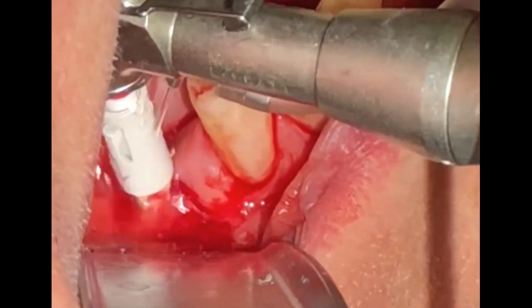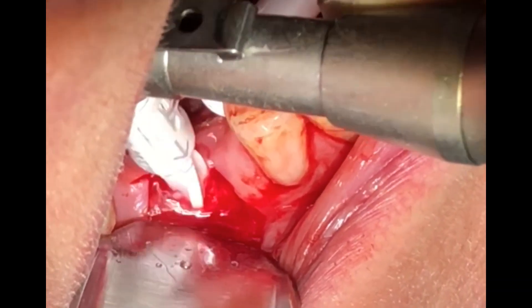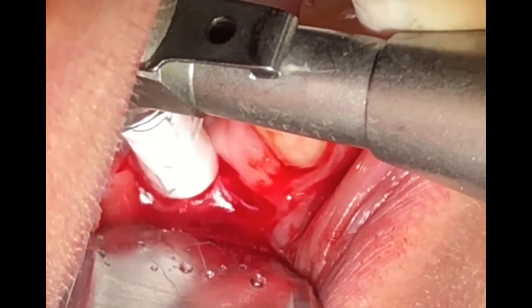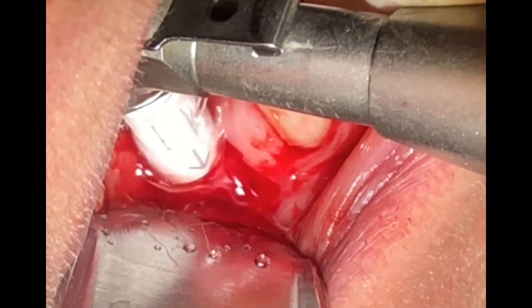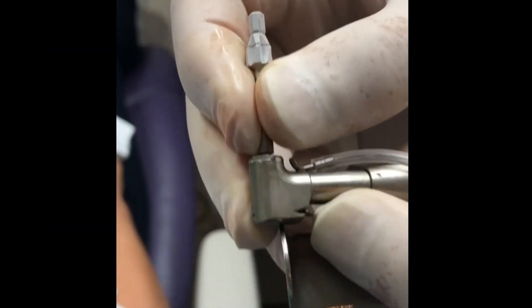After the pilot drill, we take an x-ray to determine the position of the initial osteotomy — which I haven't shown here — before we proceed with the remaining diameter drills.